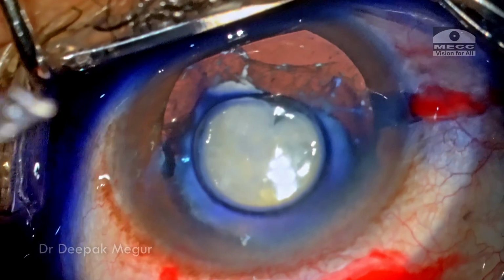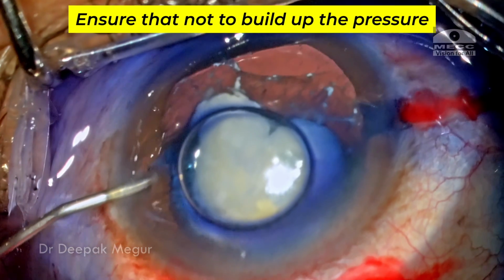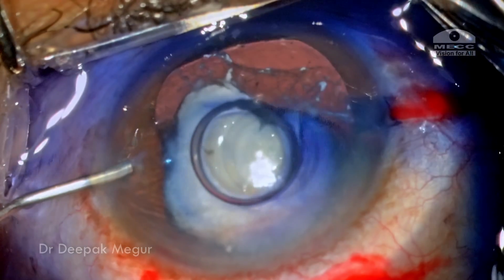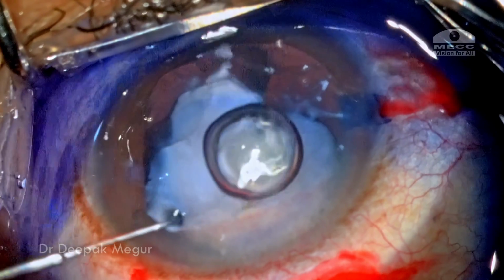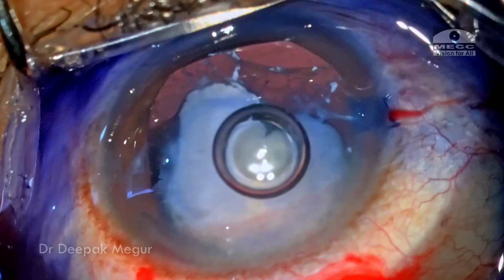The stain is then irrigated out using BSS. Again, care is taken not to build up the pressure. I'm just pressing down on the side port incision so that there is easy egress of the fluid. This will prevent the fluid from getting across this zonular dehiscent area into the vitreous cavity.